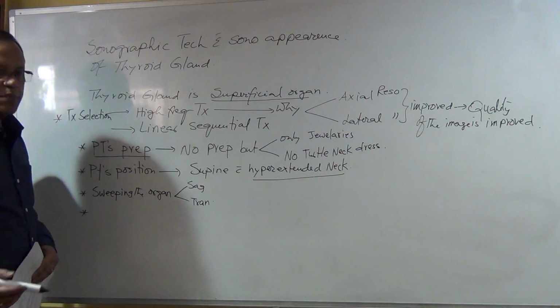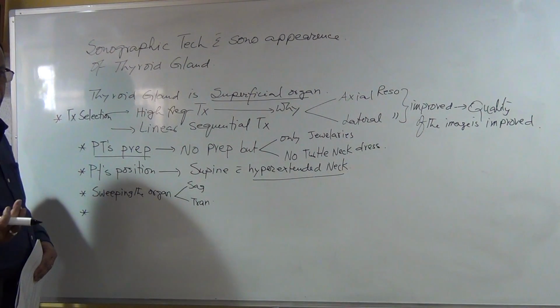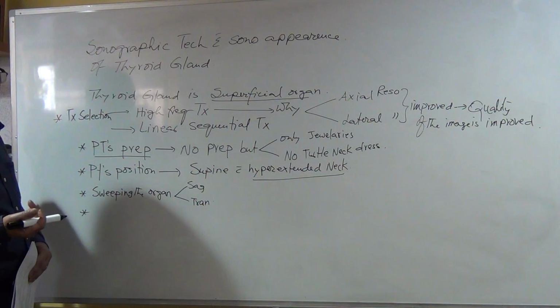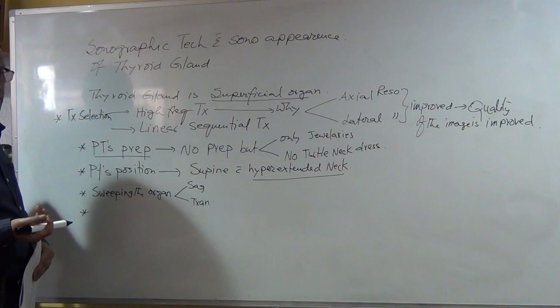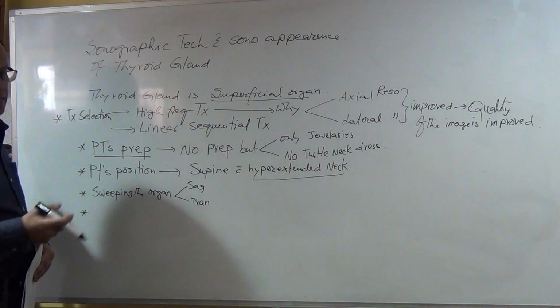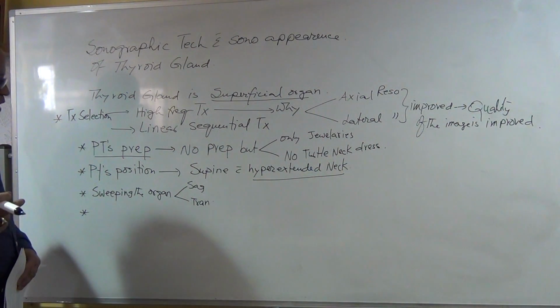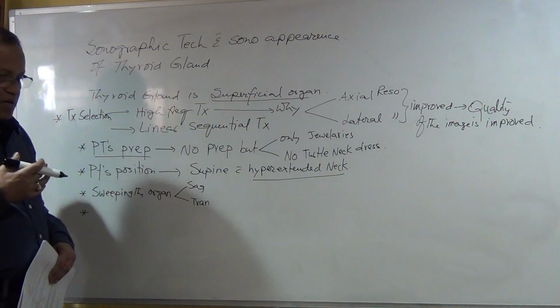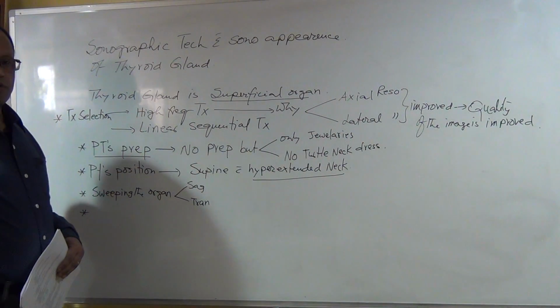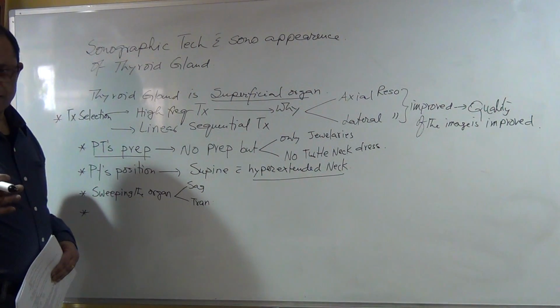Why swiping? Swiping will give you a quick evaluation. It takes maybe 30 seconds, not even 30 seconds. If there is a pathology, then you can see, oh yes, there is a pathology here. And if there is no pathology, then you can have a fresh mind. Oh, I saw preliminarily that there is no pathology. That means it is an easy case.